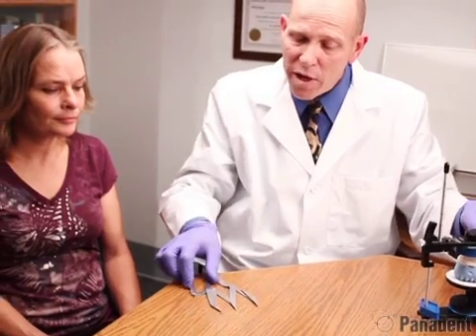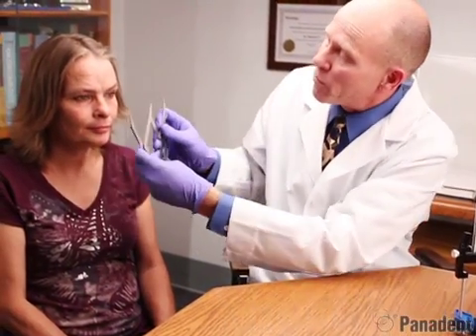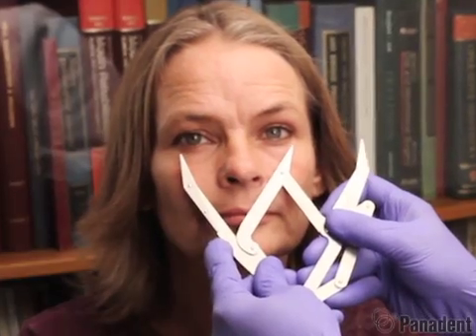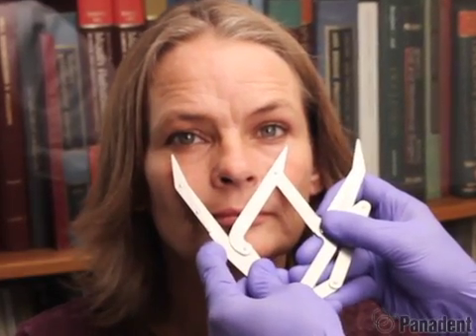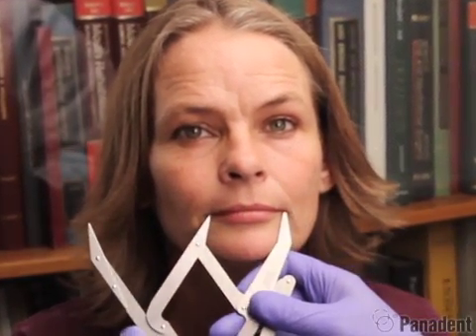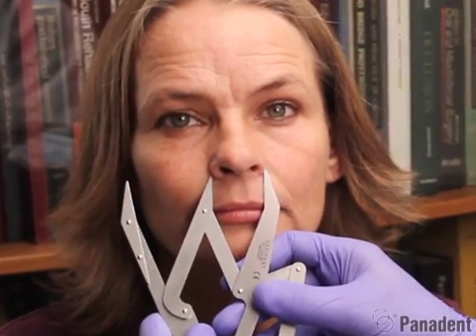We can also evaluate lateral proportions of the face. If we measure the lateral canthus of the eyes, it is about 60% wider than someone's mouth. Then if we re-index the width of the mouth, it would be approximately 60% wider than someone's nose.